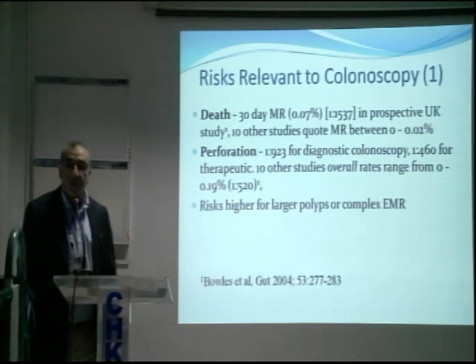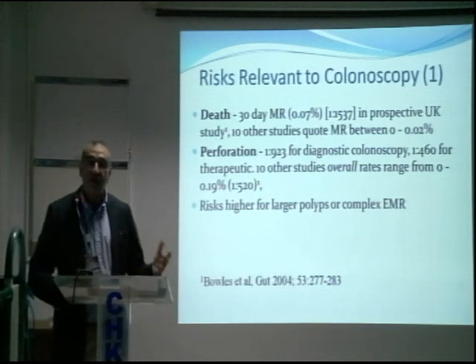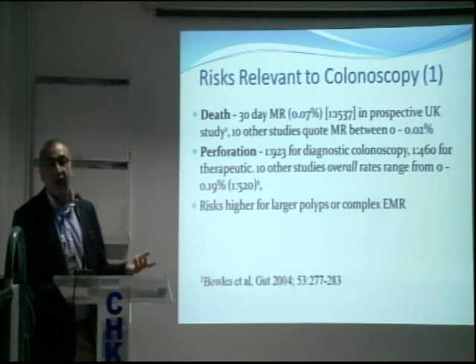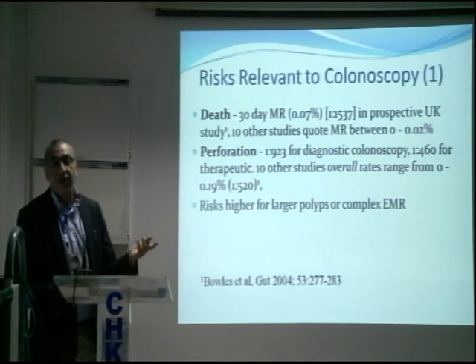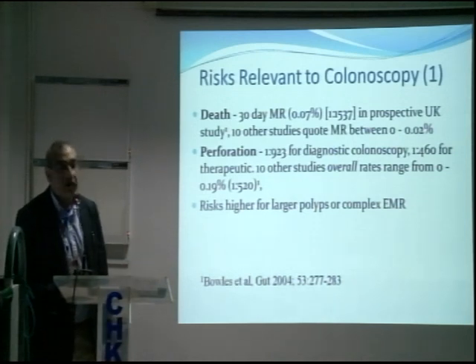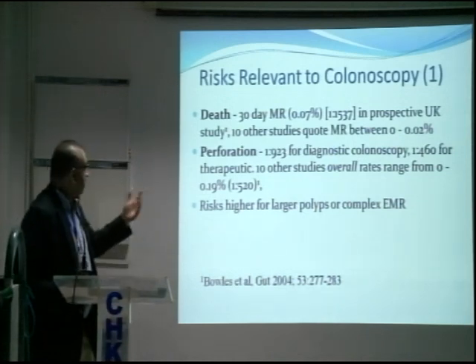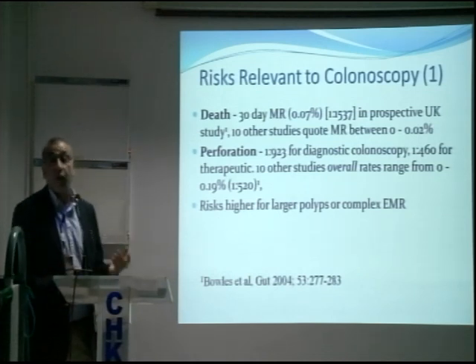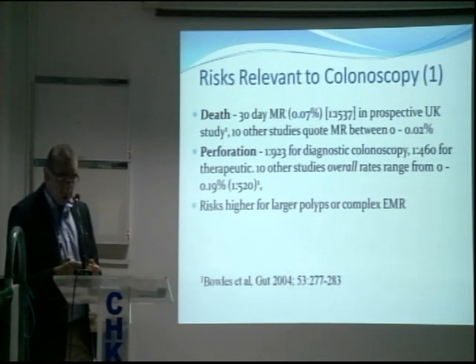For a therapeutic procedure, the incidence is different, because if you only select therapeutic procedures in your data, it is much higher. It can be up to 1 in 500, or even for big polyps and EMRs, it can be as high as 1 in 250 cases. So that is again a complication that your patients have to be made aware of, because they should know what they are letting themselves in for.